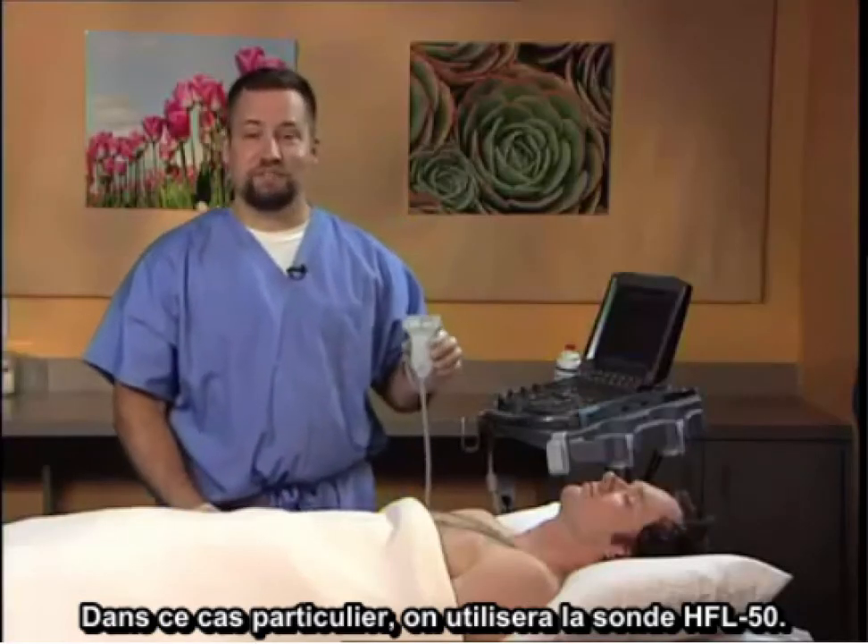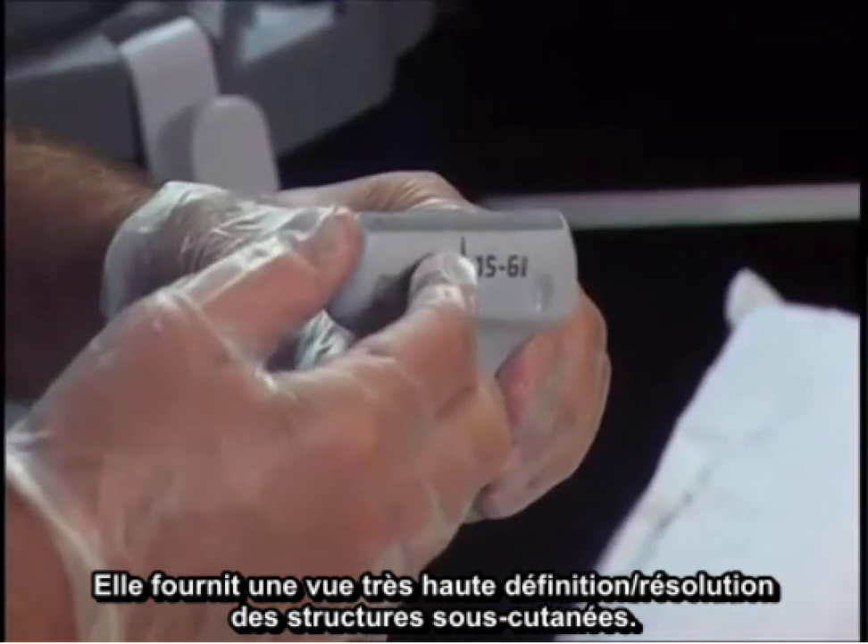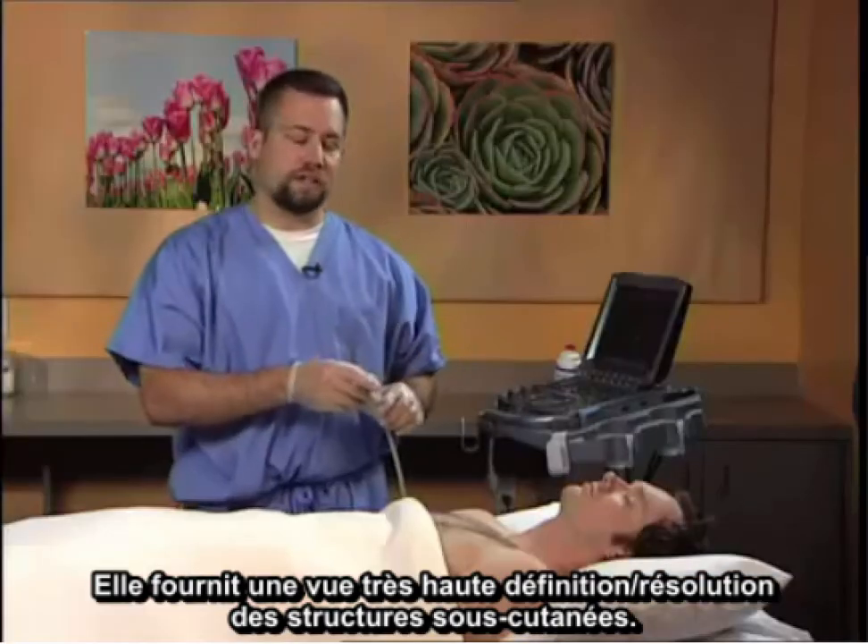In this case, the HFL50 probe will be utilized. It provides a very high definition, high resolution view of the subcutaneous structures.